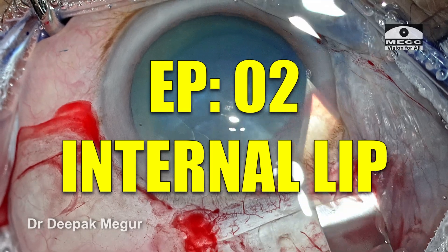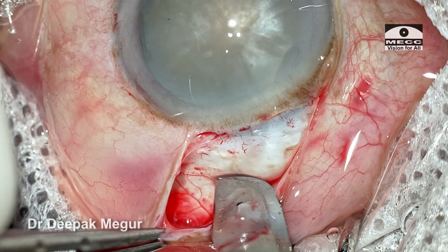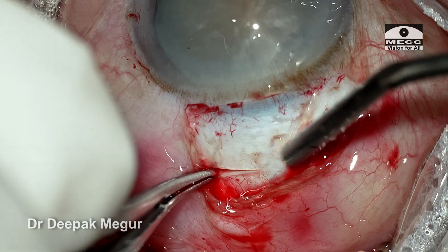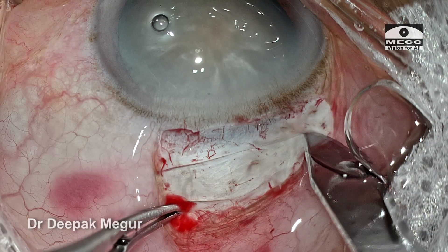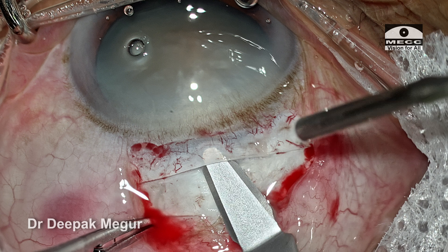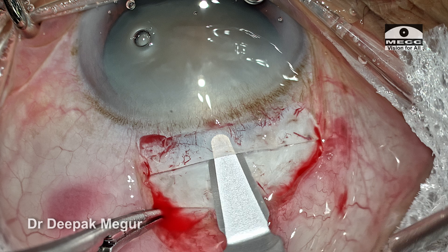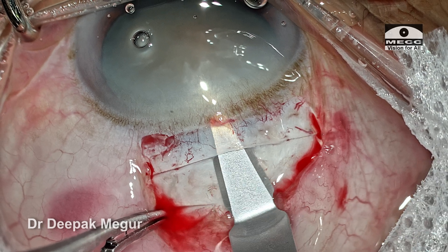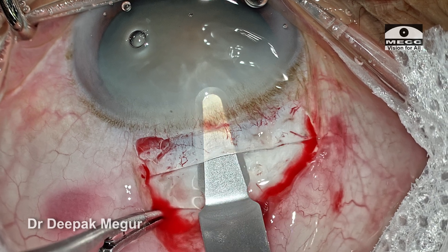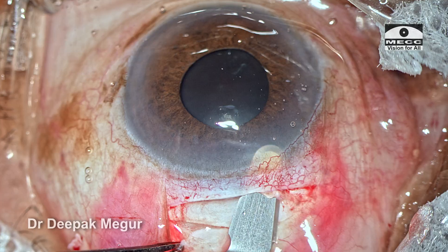The next episode will cover the creation of the internal lip in detail. Let us revise: find a good way to stabilize the globe — I prefer and recommend the posterior fixation groove for beginners. Turn the globe slightly down away from you. Create the appropriate depth scleral groove. Start the tunnel in the center by the wriggling movement. Be mindful to change the angle just as we reach the limbus, just a bit to respect the corneal curvature. Continue the wriggling motion until 1.5 mm into the cornea, then do the lateral extension by sweeping movements — either the back sweep or the front sweep.